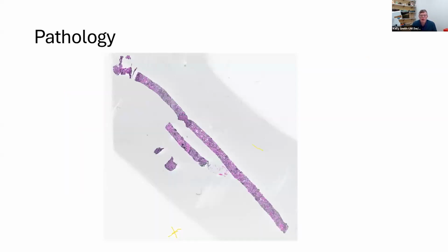We're just not there. So this is the biopsy from the patient. And we'll look at a little bit higher magnification. And we can see here there's some globally sclerotic glomeruli and other glomeruli that are patent. If people want to X out some of the globally sclerotic glomeruli and some of the patent glomeruli, or put a circle around patent glomeruli, that'd be great.